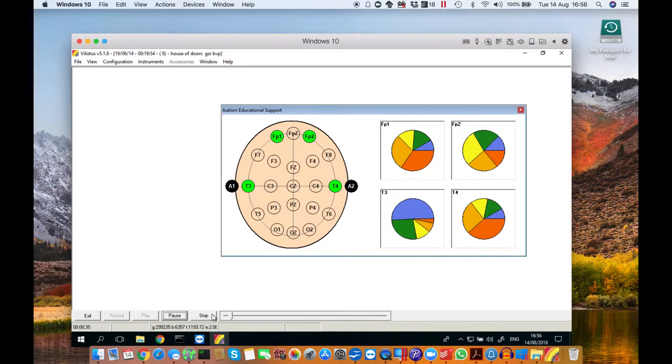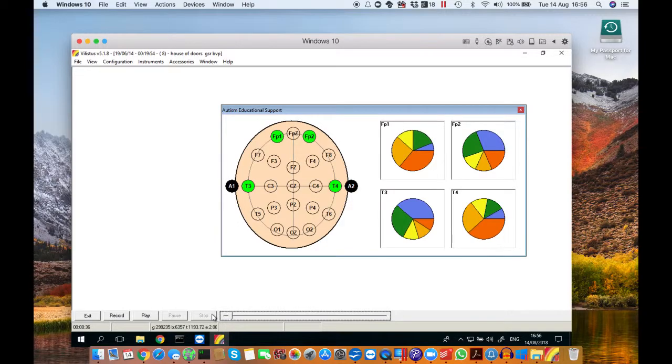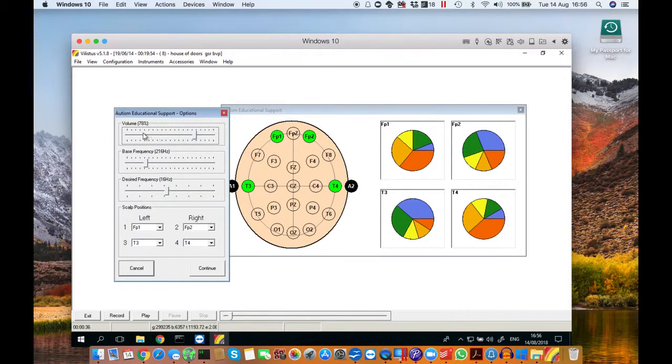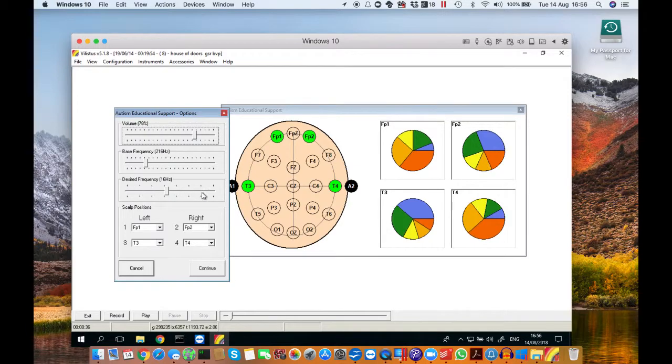This software is very easily configurable as well. You go to configuration, AES setup and you'll get a little window saying volume, base frequency, desired frequency and scalp positions.